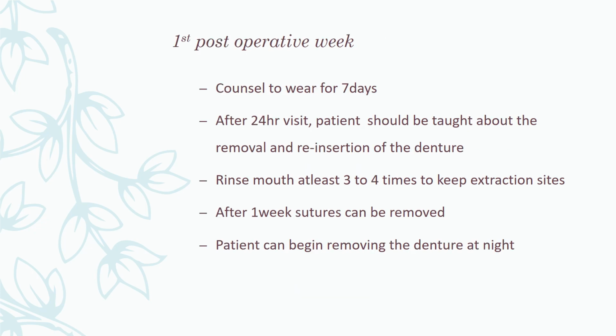After the first post-operative week recall, you have to counsel the patient to wear it for 7 more days and see how things work. After 24 hours, the patient should be taught about removal and reinsertion of the denture. The patient should be able to rinse at least 3 to 4 times to keep the extraction sites clean. After 1 week, sutures can be removed, and the patient can begin removing the dentures at night.